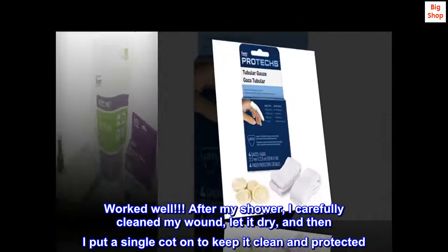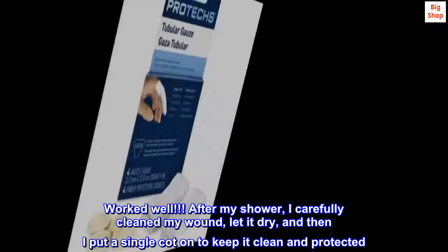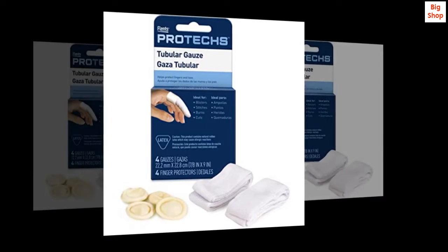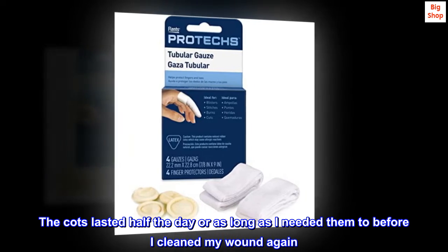After my shower, I carefully cleaned my wound, let it dry, and then I put a single cot on to keep it clean and protected. The cots lasted half the day, or as long as I needed them to before I cleaned my wound again.